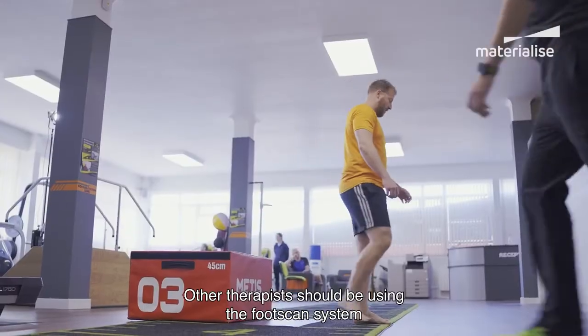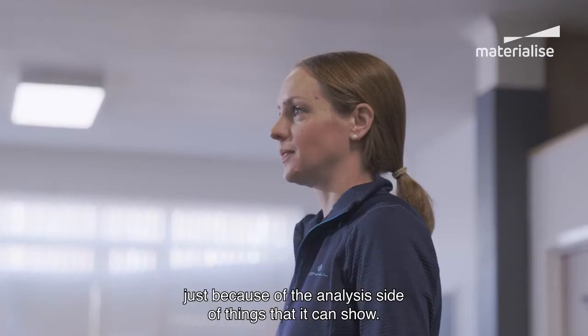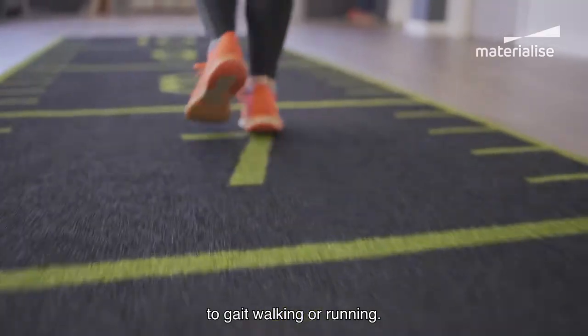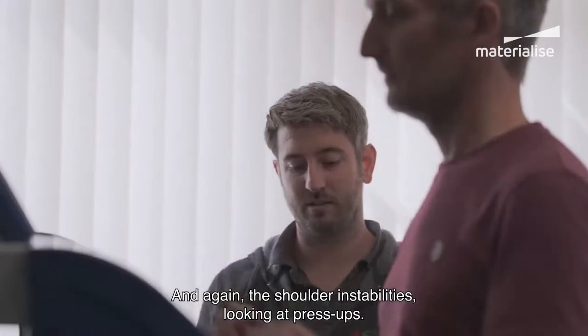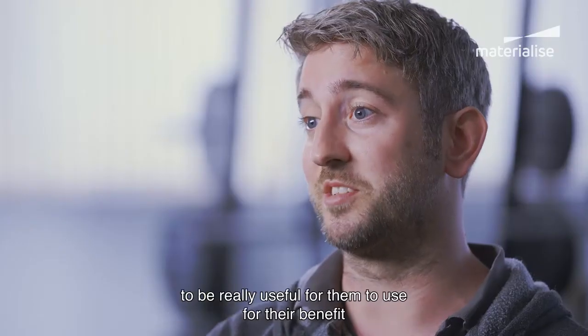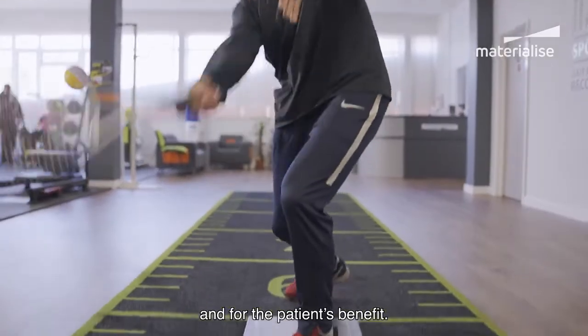Other therapists should be using the foot scan system just because of the analysis it can show — anything from squats or lunging technique to gait, walking or running, and also shoulder instabilities looking at press-ups. For a PT or physical therapist it's going to be really useful, both for their benefit and for the patient's benefit.